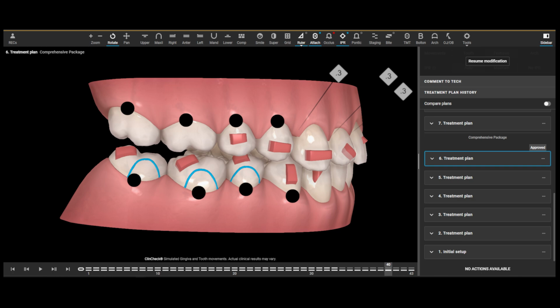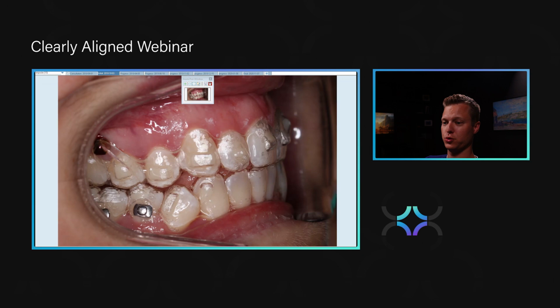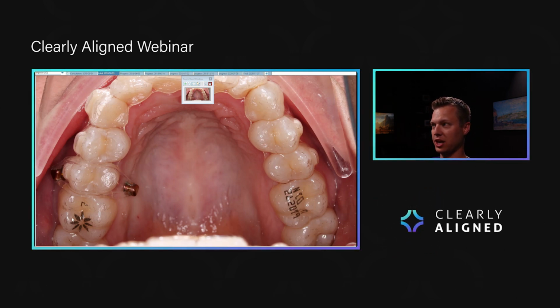Well, we need to go ahead and place the TAD into the buccal shelf, or the buccal of the upper. And in this case, we're just placing it right between the two roots. And on the palatal, we're just, again, going to be placing it right between the two roots. And the elastic then is going to hook on over top. I don't know if you can see it here, but it's hooking on after the tray goes in.